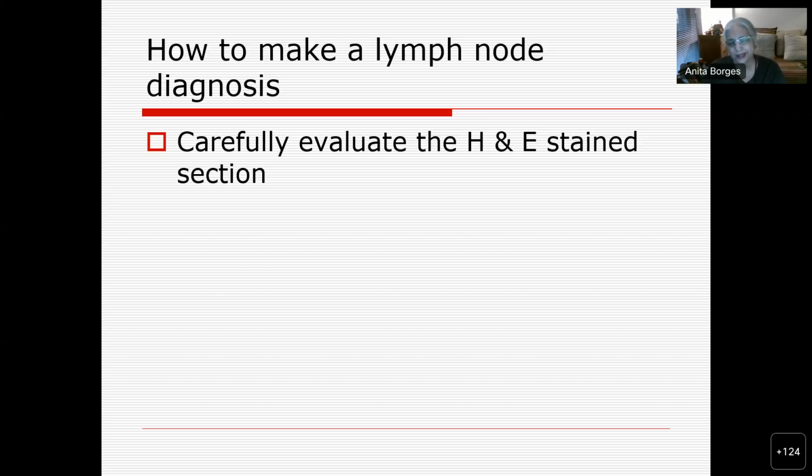If it's a flat lymph node, most often flat lymph nodes are not pathological. You just get flat lymph nodes sometimes when you are dissecting out lymph nodes in the axilla or in the groin or somewhere else. But most of the time, a lymph node is swollen, and then you cut it perpendicular to its capsule, or perpendicular to the long axis of the lymph node. So you get many sections which have the capsule intact.